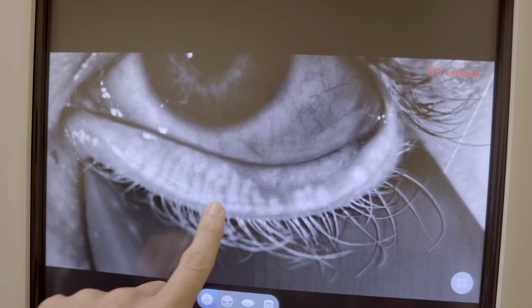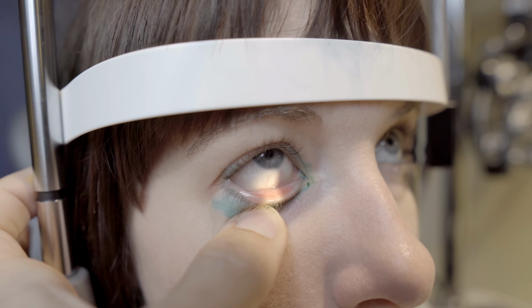Now right away I do want to mention that the examination that we're walking through and all these tests are pretty comprehensive compared to a lot of other clinics that I've been to, so depending on where you live and what different dry eye specialists in your area may offer, you may not see all of the tests that we're doing. But my hope through this video is whether you come to see us or you do see another dry eye specialist, that you'll better understand what all of the tests they're going to be doing and what they translate to, like what they mean to us as your doctor and how that helps us guide what treatment's going to be best for you.